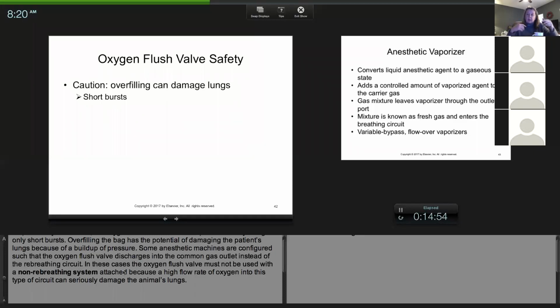So I just always tell students, when you go to externship your very first day, just make sure you get used to the machine, maybe hook it up, you know, and not on a patient, and make sure you're familiar with how it works. Like I said, I wouldn't want to go in cold turkey. You guys are kind of spoiled at school because we have nice newer machines and things are labeled and things are set up.